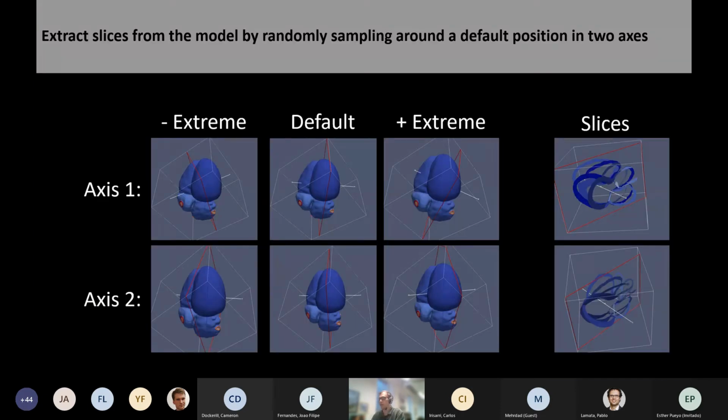And another axis of variability is how the slice is extracted. In most cases, you're not going to have somebody extract a perfect 4-chamber slice because it might be slightly foreshortened, which means they didn't get the apex exactly, or it might be slightly rotated. So we also simulated this in how we extracted the slices. We didn't extract perfect 4-chamber slices every time. And again, that added additional variability to the data set that we are creating.